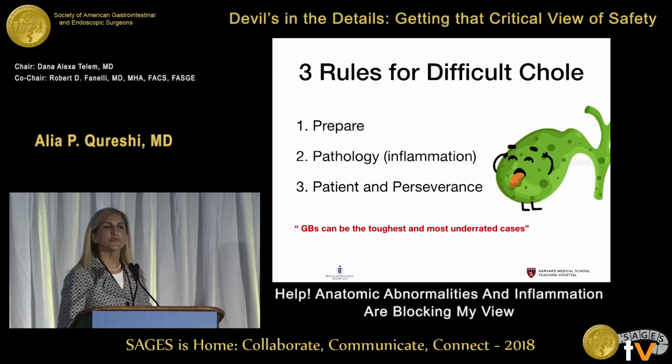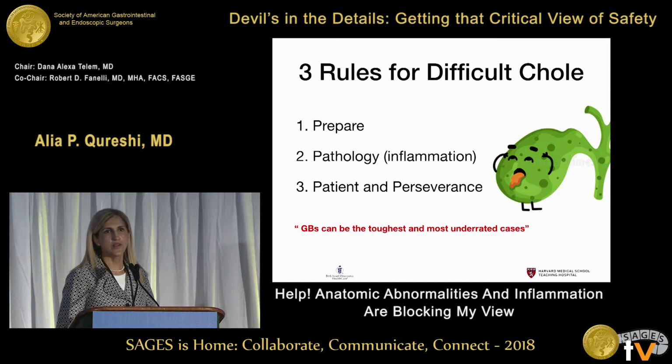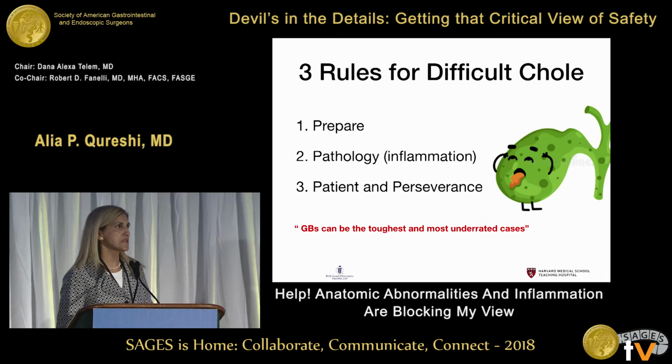So my 3 rules for a difficult chole that I always teach my residents: prepare, meaning know your imaging, know your patient's comorbidities, think about the pathology as I just stated, and perhaps most importantly, be patient and persevere. Go through this operation very thoughtfully. This is not one of those cases you try to rush through, or you will be very sorry, as will your patient.